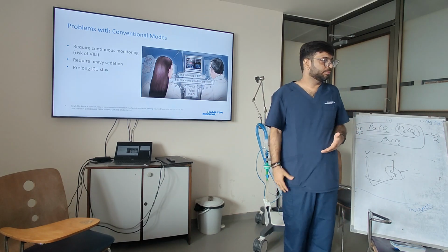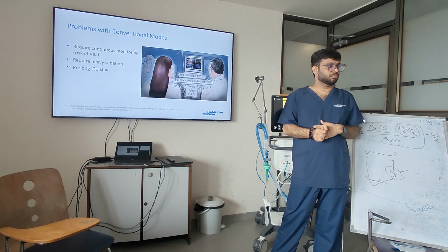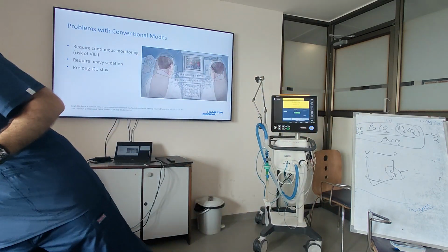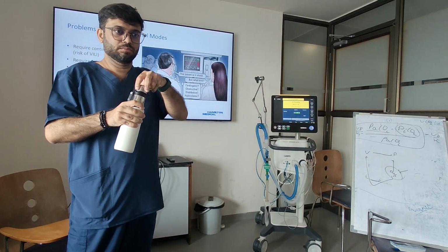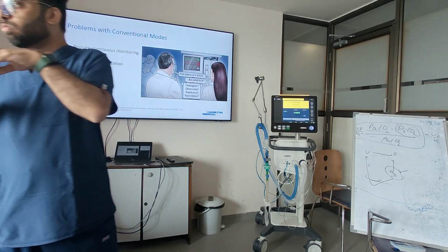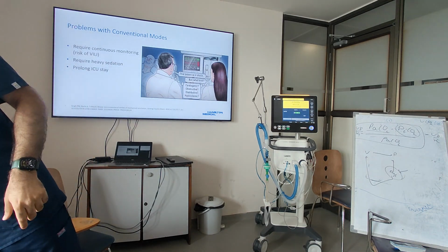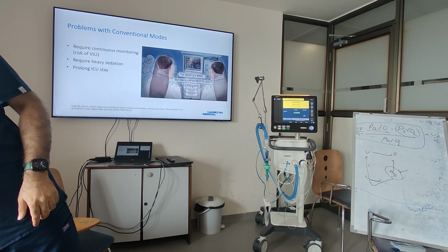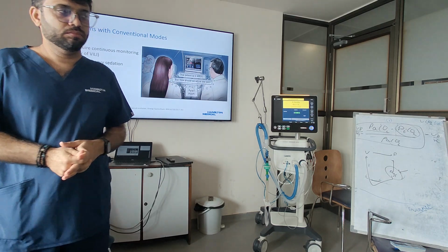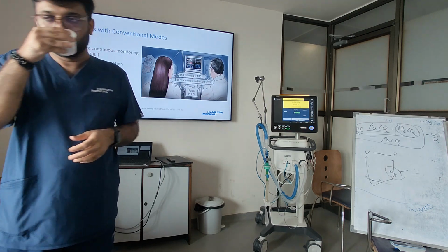Yeah, because when a person is on assist control mode, he is not controlling. He's controlling one aspect, the trigger. Otherwise, he's not controlling anything more than that. He's not controlling the volume. It is so difficult for a person who is now awake but sleepy to coordinate with the ventilator, because it's not his respiration. It's really not his respiration, isn't it? So it becomes so difficult. That's why these people require an escalating dose of sedation, or we are left with the situation where you tolerate it. Are you understanding? Yeah.